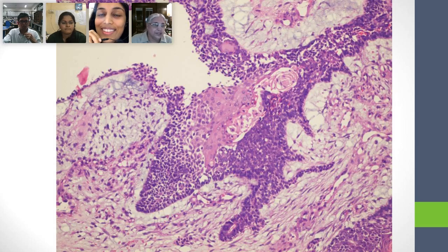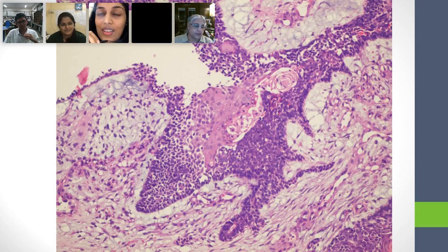So all of you are stuck as to how to define dysplasia. Have you ever seen a colonic adenoma? You know, adenomatous polyp in the colon. Is that epithelium dysplastic or not dysplastic? It's an adenoma. So what is the meaning of that dysplasia? And do we have to compare with something? So, we have an issue over here.